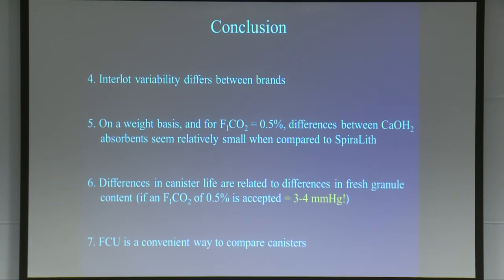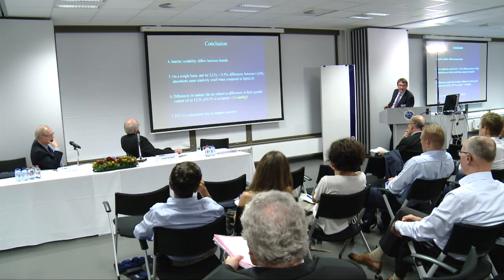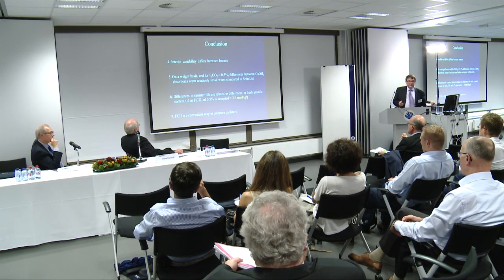Differences in canister life are related, at least in part, to differences in fresh granule content. And I think FCU is a convenient way to compare canisters. Again, all this information should be in the handout, and I'll post them on the website later. Thank you.